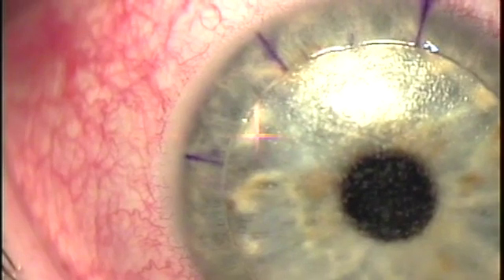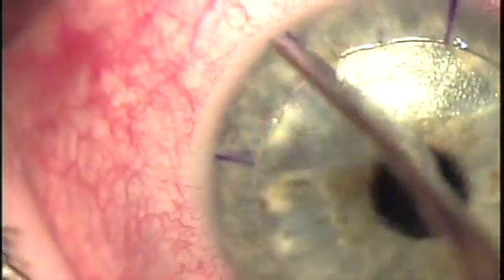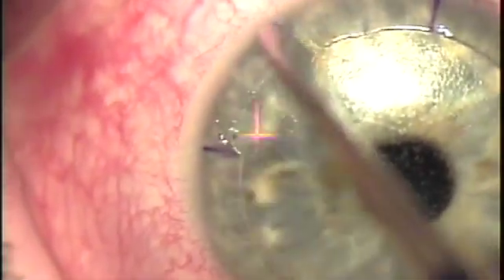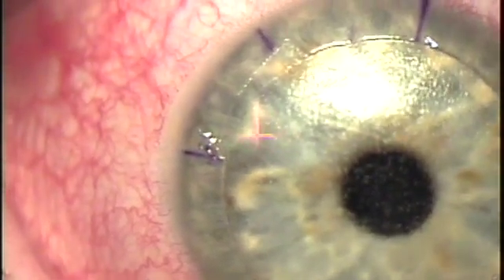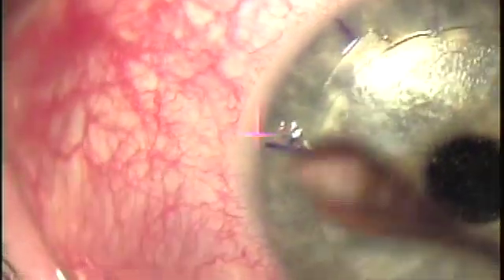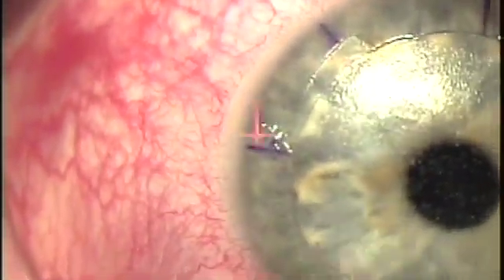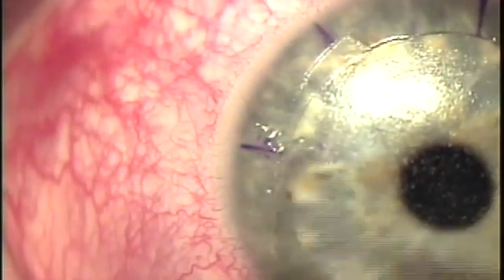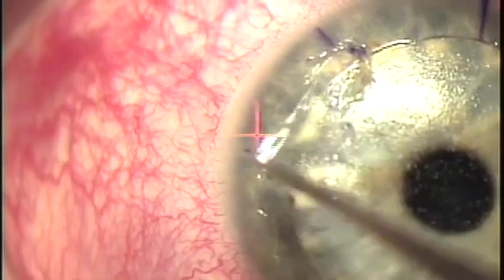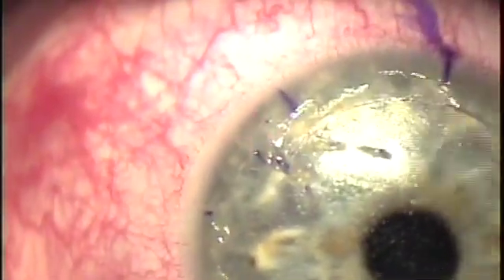The small levels of ingrowth are not dangerous to vision, but larger levels of epithelial ingrowth, perhaps ingrowth of 1, 2, or 3 millimeters into the flap, can distort vision and also lead to flap necrosis and decrease in vision. So in the NIFT technique, we try to give the flap a head start in its healing ahead of the cells at the edge of the flap that have a tendency to migrate under the flap edge.